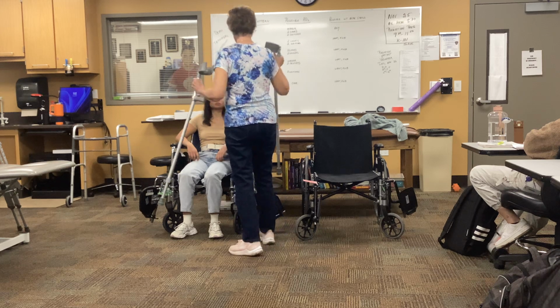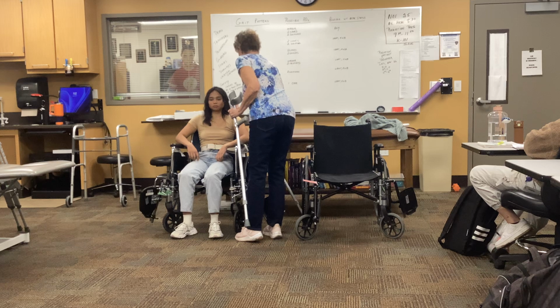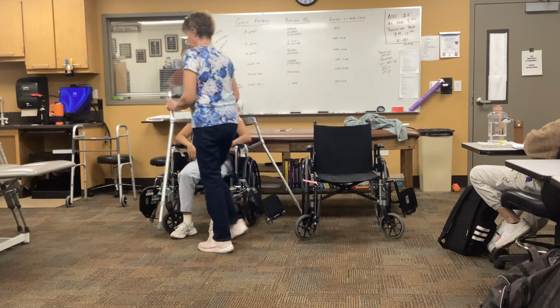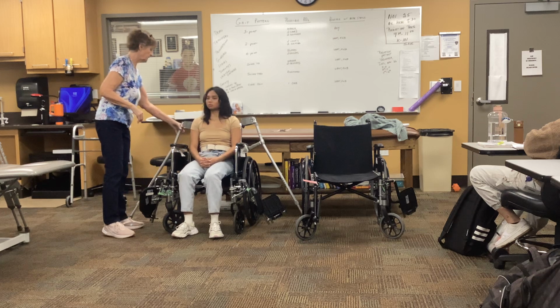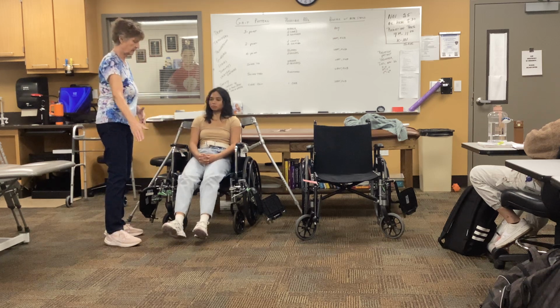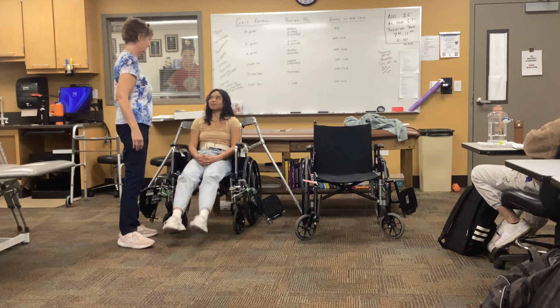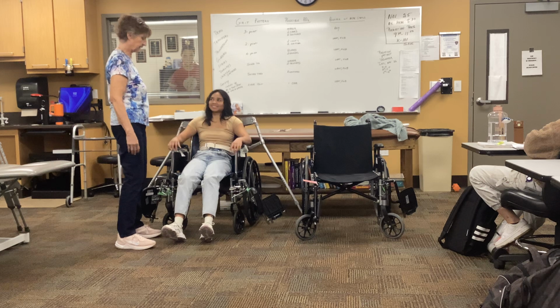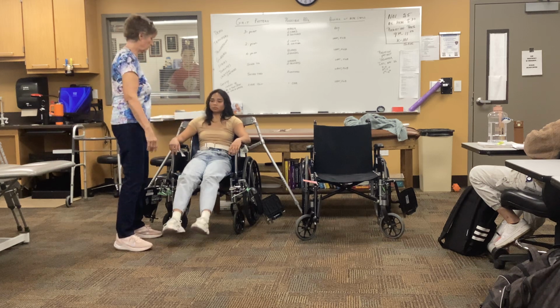We'll go for the turnaround method first, which will probably be a little bit easier for you guys. All right, so your legs are straight out in front of you. What you have to do is not bend your knees. You will have locked the braces, knees straight out.